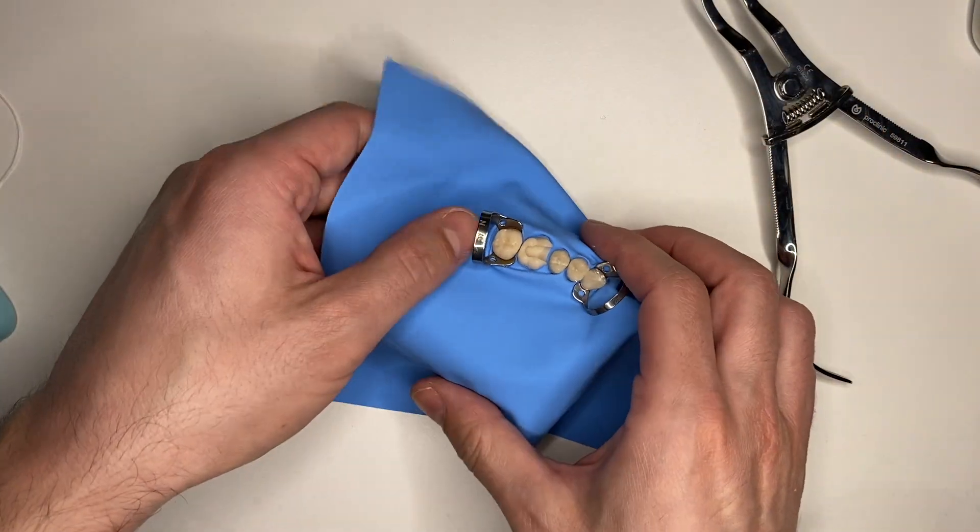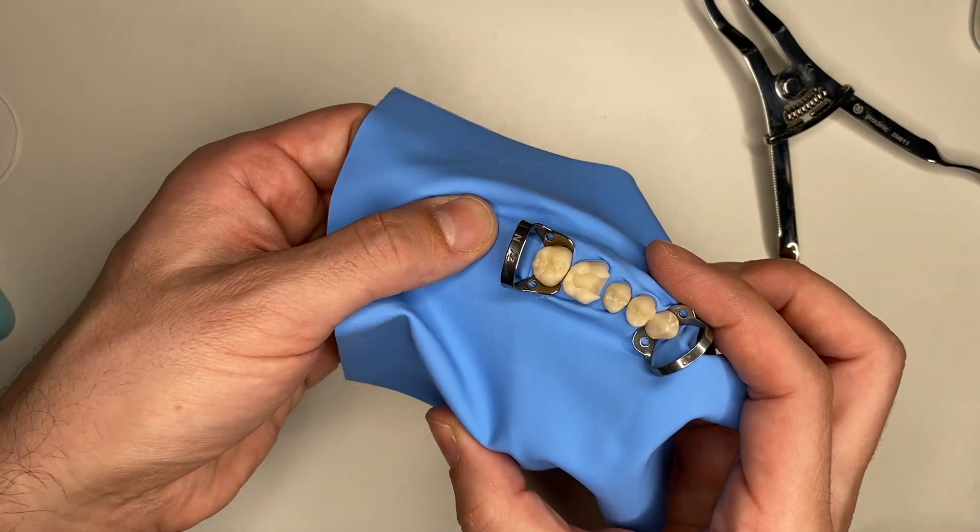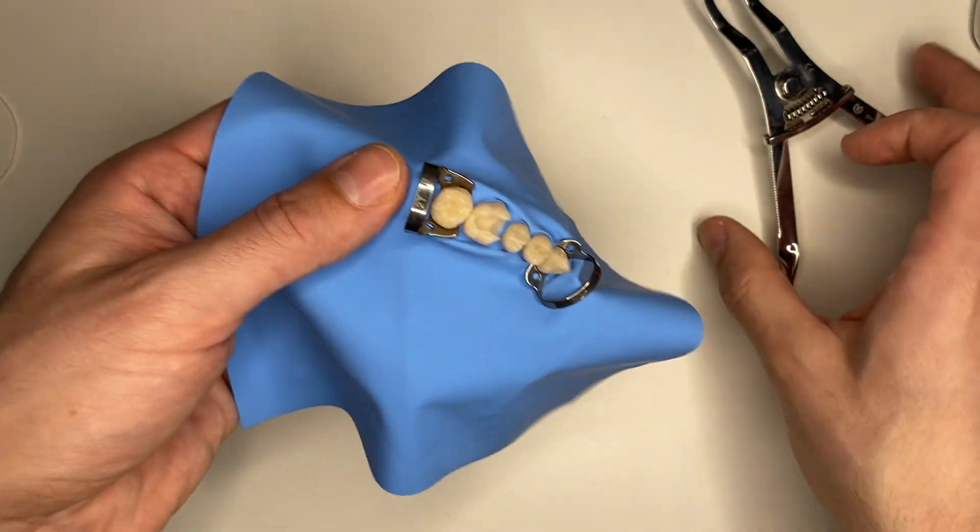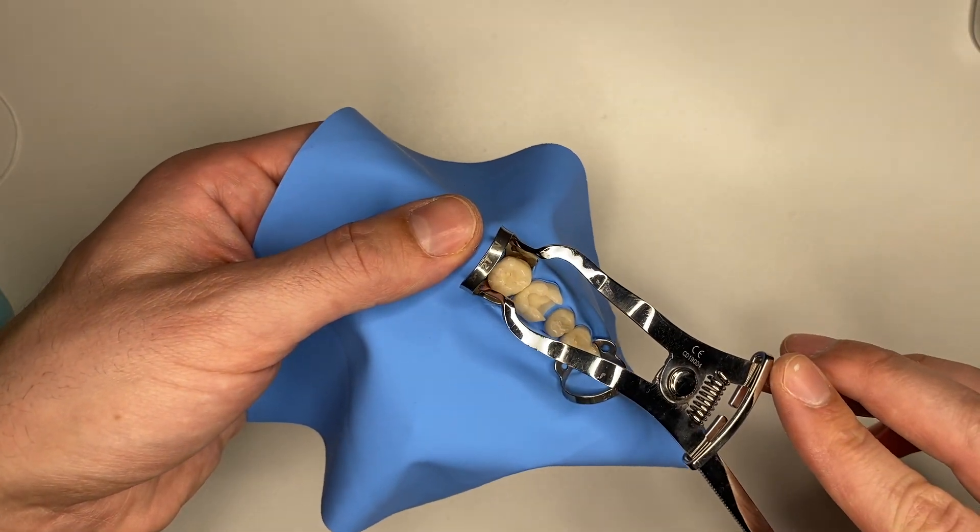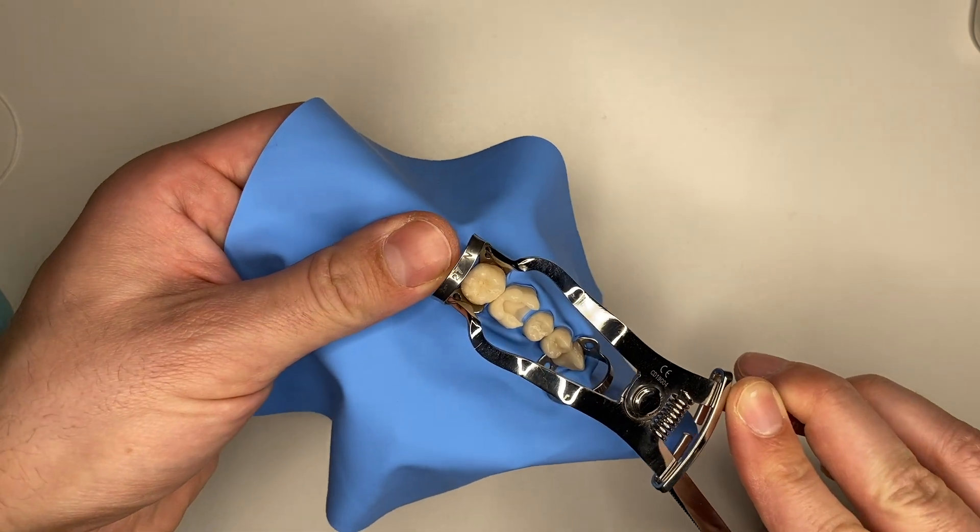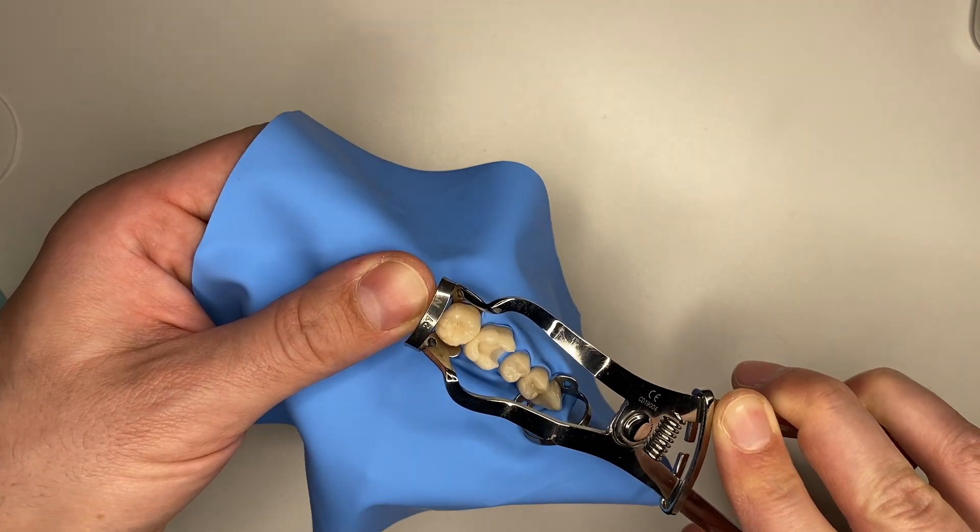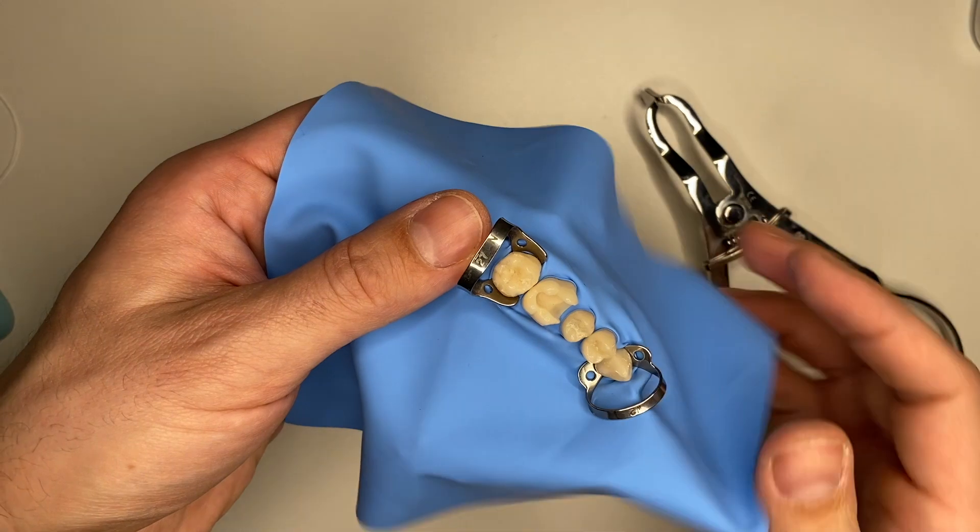Another thing, please have a look here behind my last molar. You can see the rubber dam isn't properly seated there. I just gently pick up the rubber dam clamp towards the palatal and then do the same towards the buccal. Now it's perfectly seated there as well.